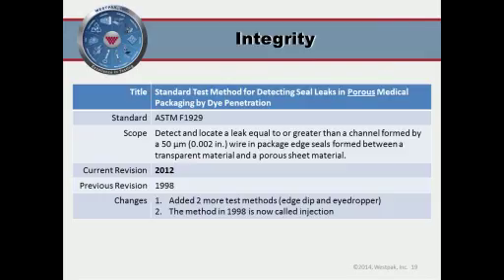We have a question from the audience relating to conditioning. Does conditioning always come prior to distribution? Are there cases where you should condition after the distribution test? Most of the time we will condition prior to the distribution testing. The reason is that when you're doing conditioning, you are subjecting mainly your corrugated material along with your product to extreme conditioning. So if you condition your samples before you do distribution, it will have an effect during compression, drops, and vibration. So we recommend doing conditioning before.